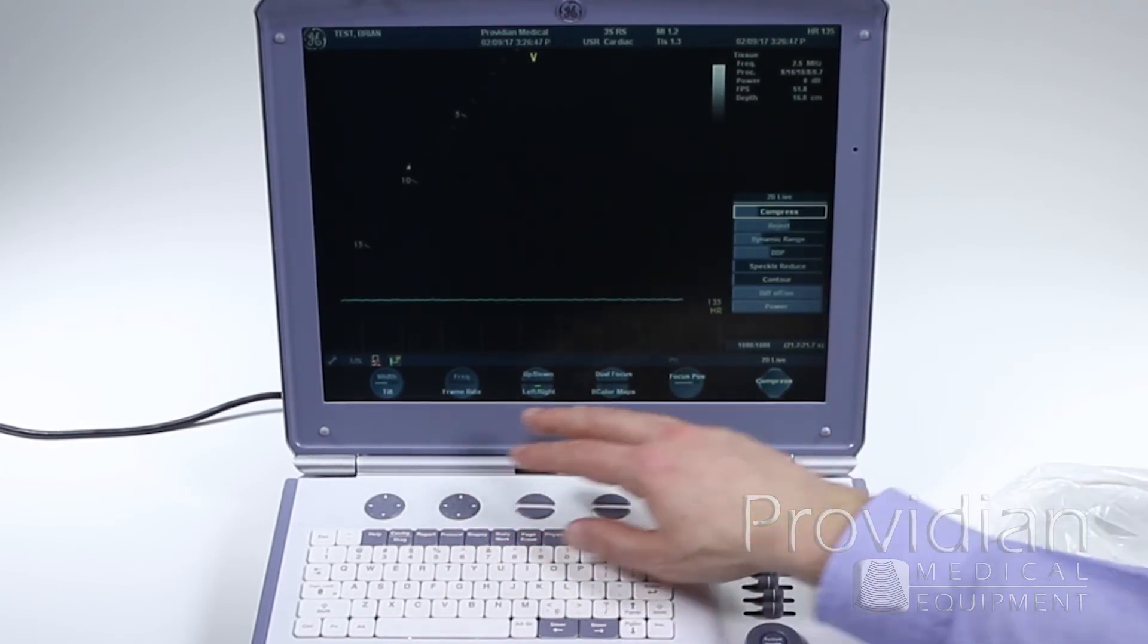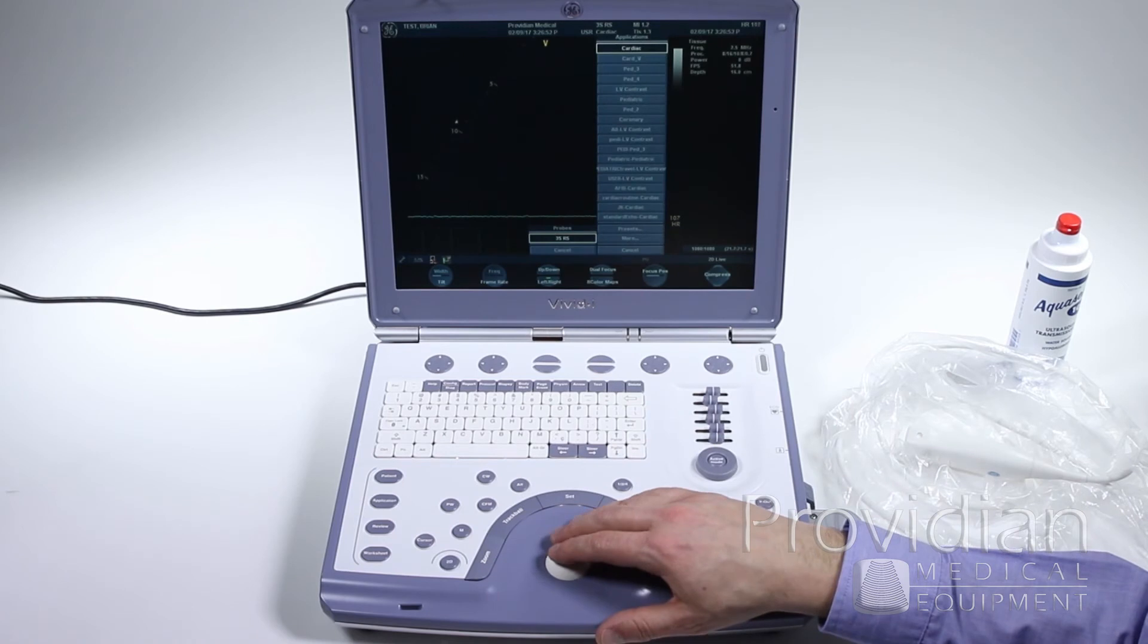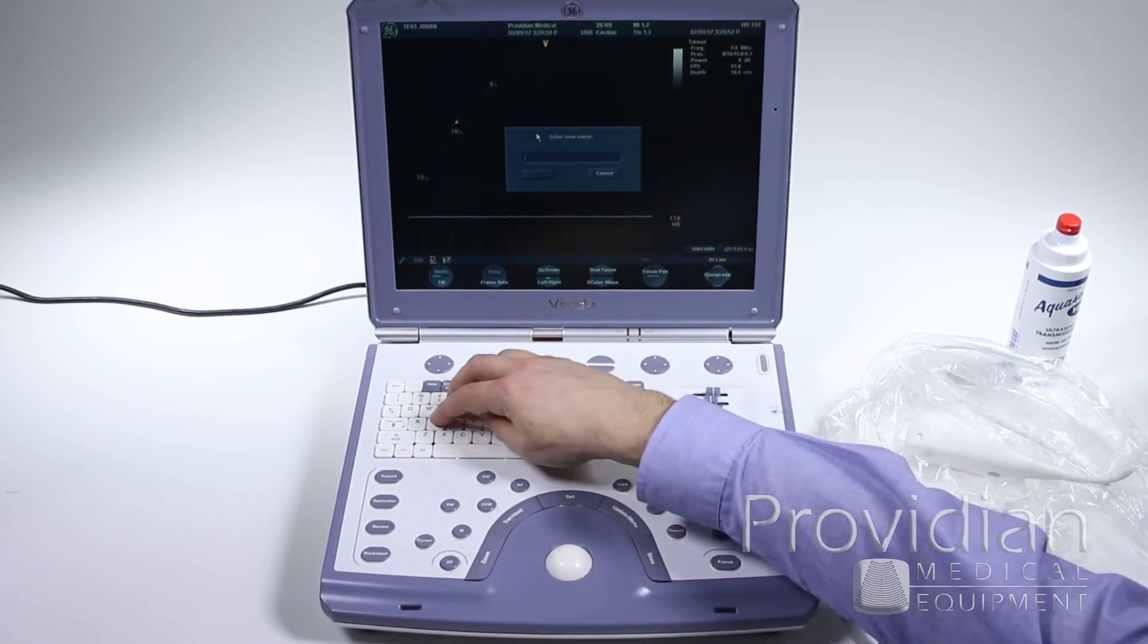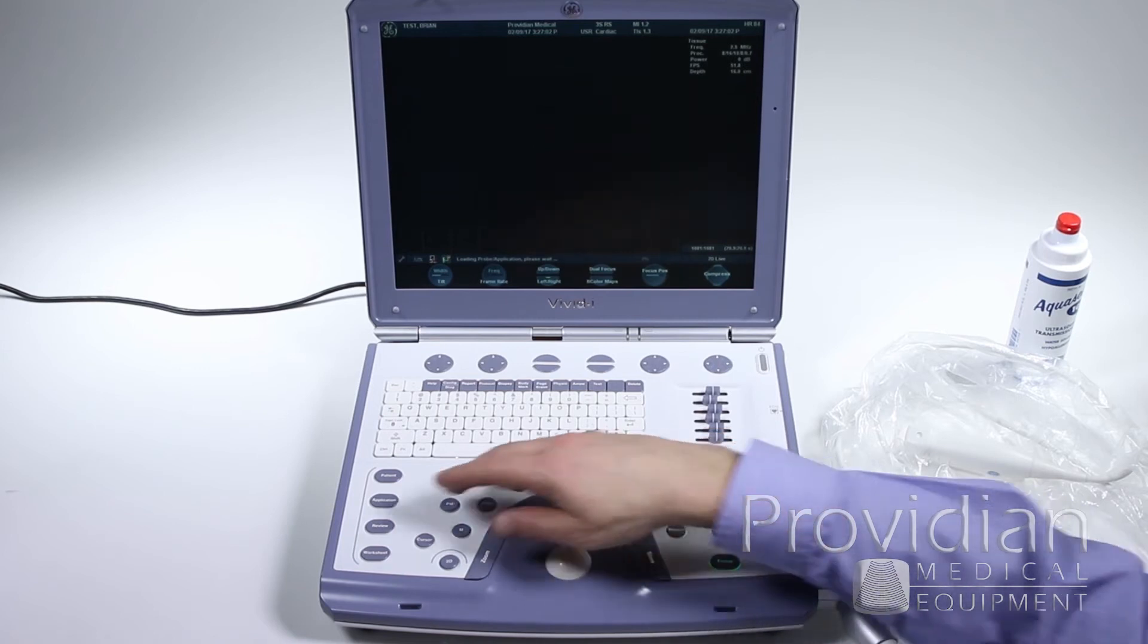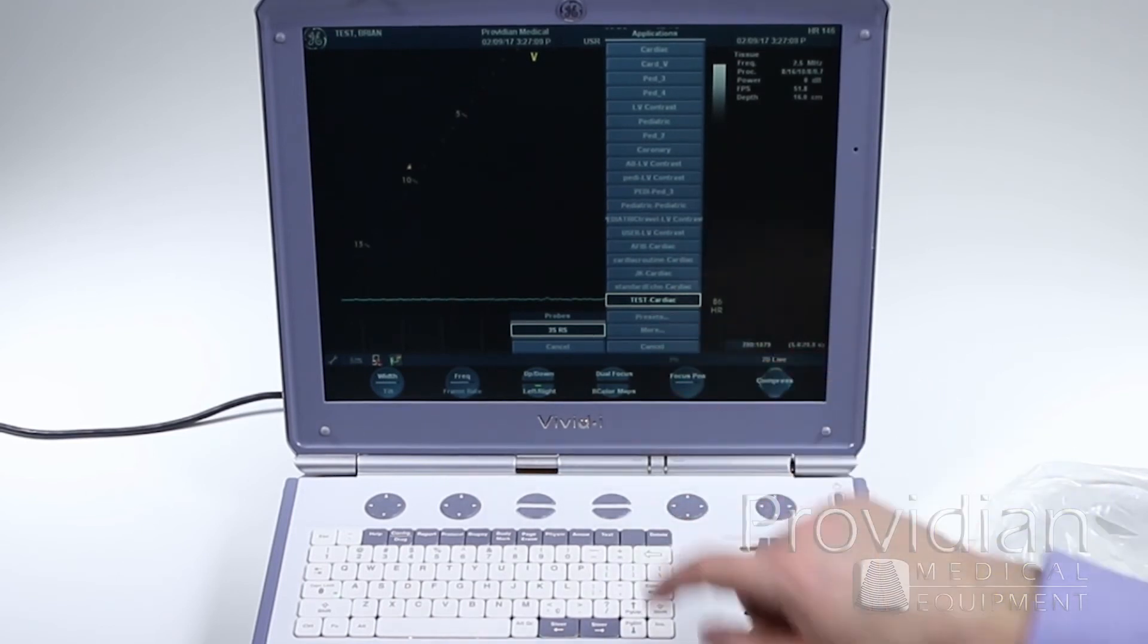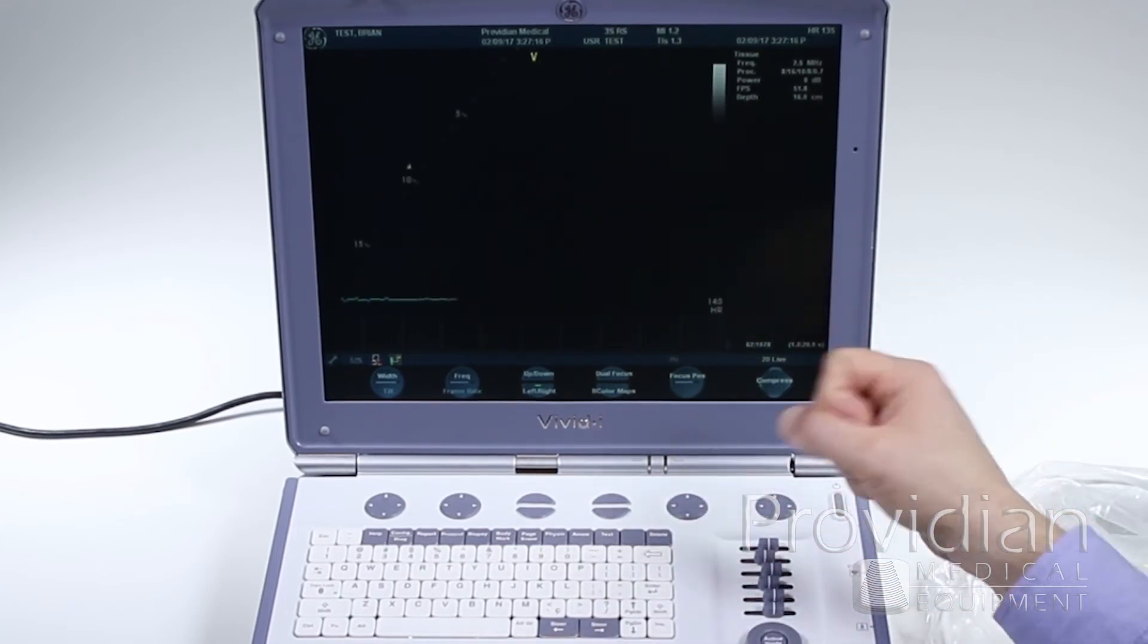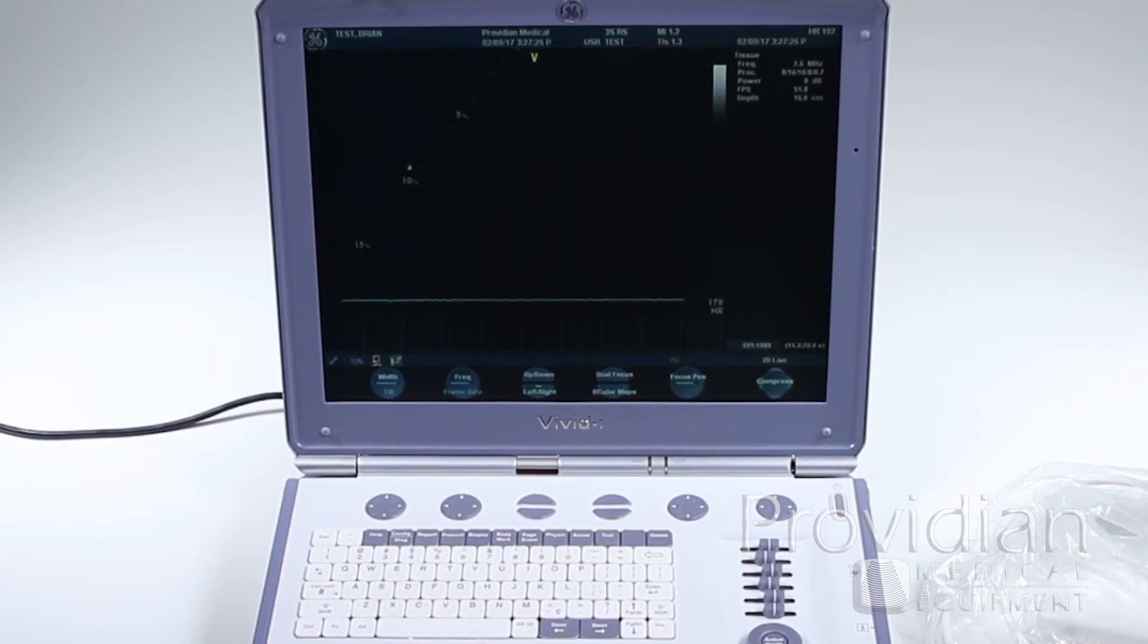So let's say I made all these changes and I like the image tilted, a different frame rate. Click on application, click set, and then click presets. I can enter my new name for a preset. I'm just going to go ahead and type in test, click save. So now when I hit that application again, it has test cardiac, and that is the custom preset I made. So each time you go to that, all those settings that you made by yourself, you can have that show up every single time you do an exam. Later on we'll show you how to move that preset to the top or bottom in that menu, whatever you'd like to do. But we'll get to that in the system setup.